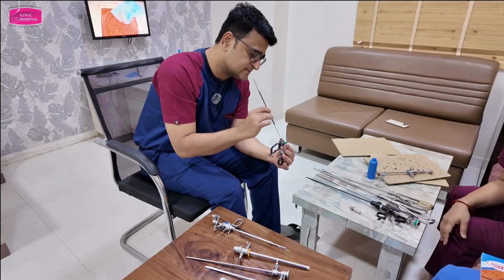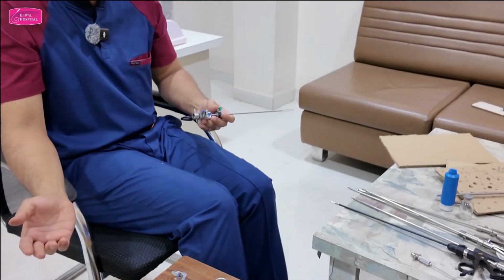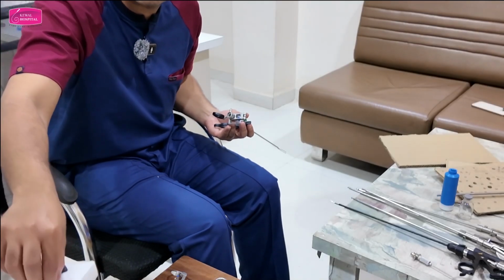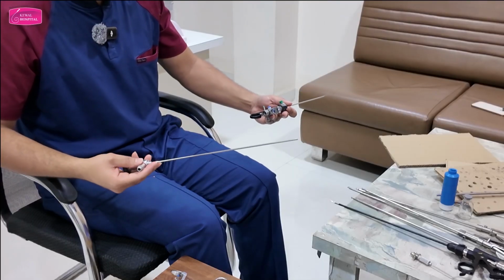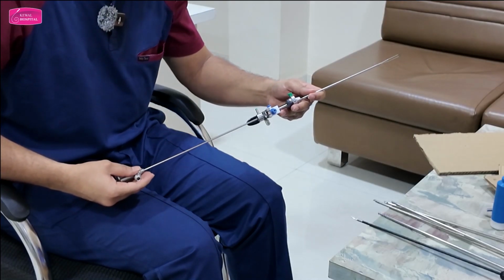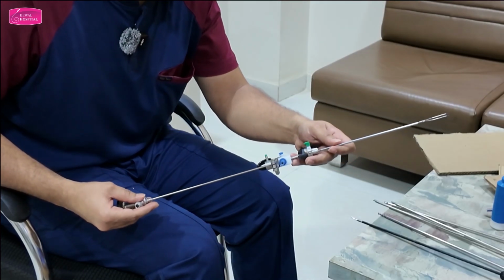Once you attach this, as I told you, scope ahead. Now this scope 2.9 is very delicate. You have to use it very carefully. Very carefully. So now this scope will go slowly inside this. So this is the problem with this kind of sheath, that the scope zoom karna.